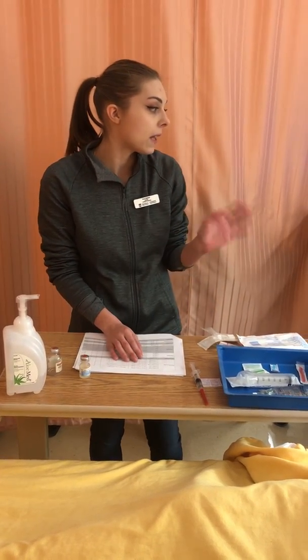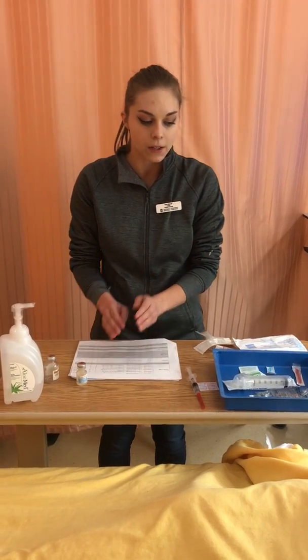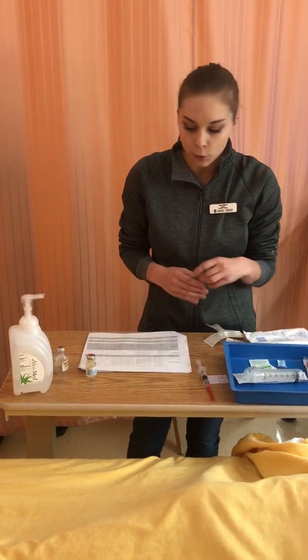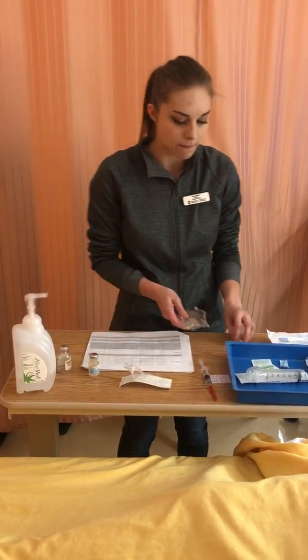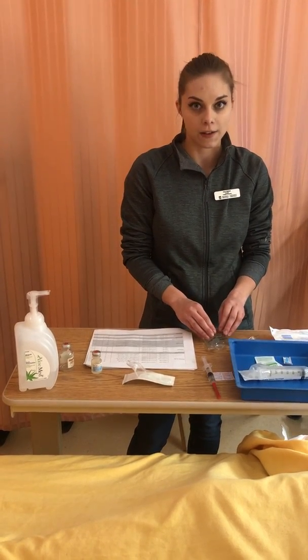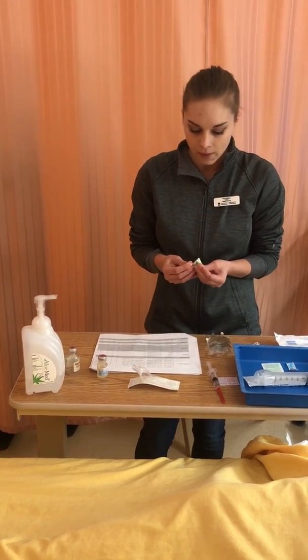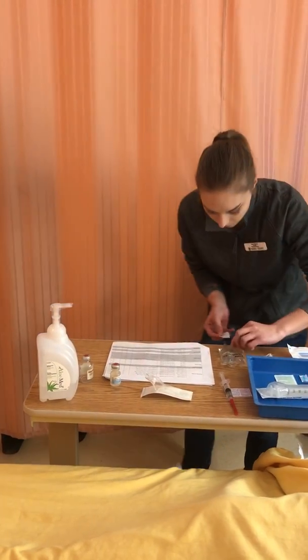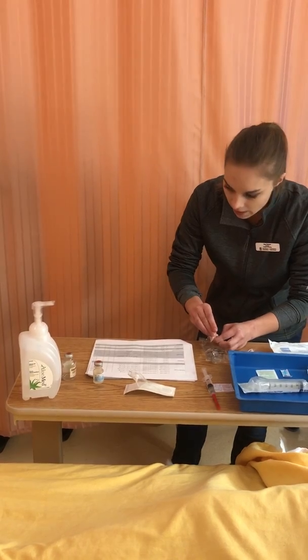I have a normal saline running as a primary, and penicillin and normal saline are both compatible, so I'm able to give it. I'm going to be withdrawing my 27 mLs from a 50 ml mini bag. Because of the mini bag shortage, in clinical I would use vials instead, but for time I'm using a mini bag. So I'm going to swab the port for 30 seconds and then let it dry.